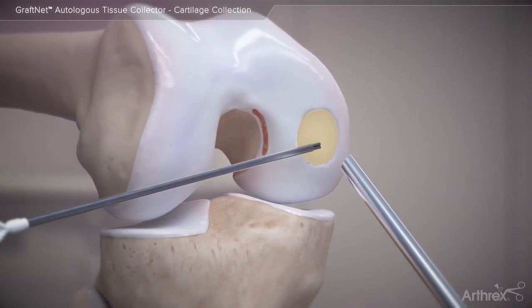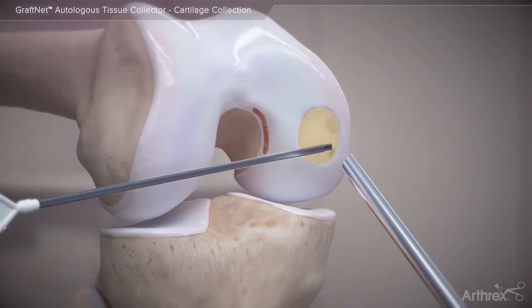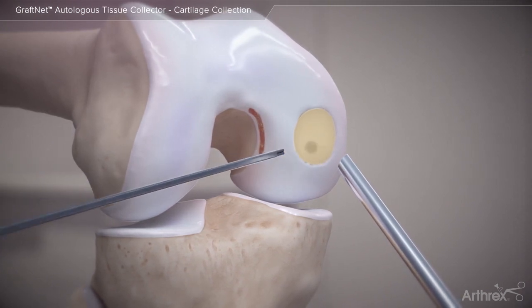The completed repair is then sealed with fibrin glue or autologous thrombin serum to stabilize the construct.